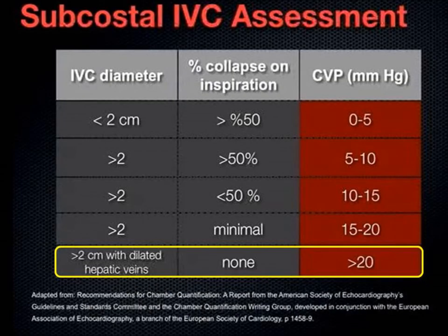Together, the previous measurements indicate that the CVP is more than 20 mmHg. This patient is actually volume overloaded and is not in need of any further fluid management.